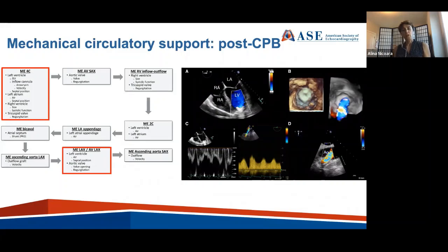But beyond that, these two mid-esophageal views are high yield for information, not only in terms of the results of the surgical procedure and placement of the cannulas, but more importantly, regarding hemodynamic management of these patients. Is the left ventricle adequately unloaded? Is the aortic valve opening or not? What is the position of the interventricular septum? And what is the function of the right ventricle? These patients can have quite a rocky and dynamic, sometimes unstable post-bypass time. So again, in dynamic conditions, a repetitive exam is very important in these patients.